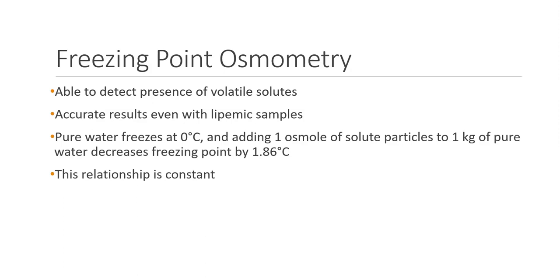It also gives accurate results even with lipemic samples. Lipemic samples, if you will recall from phlebotomy, are samples that have a lot of fat in them. Pure water freezes at 0 degrees centigrade, and when you add 1 osmol of solute particles to 1 kilogram of pure water, it decreases the freezing point by 1.86. So the more solutes that are present, the lower the freezing point, and this relationship is constant.